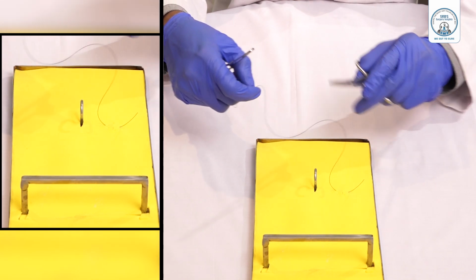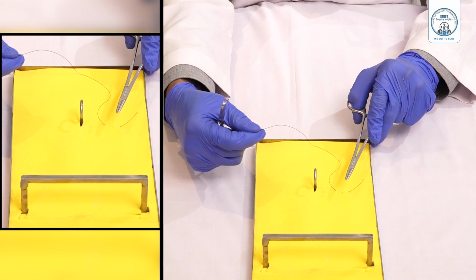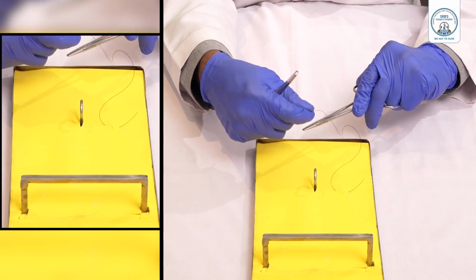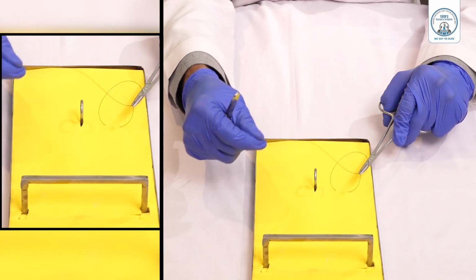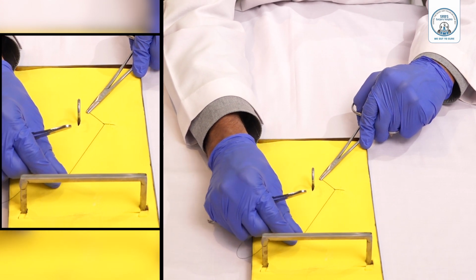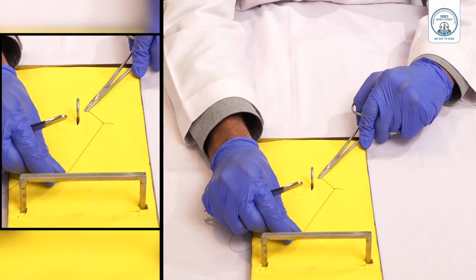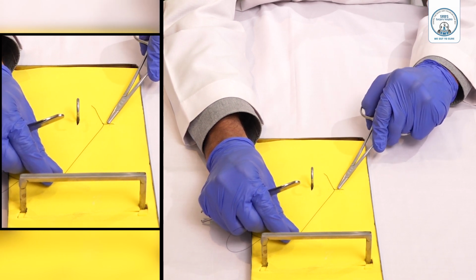Now once you do that, always hold the needle holder parallel like this, then make a loop like this, then hold the tail end and pull it to the opposite side like this. See that? It's a half knot, one throw, and the knot should come on the side of the wound, not over the wound.